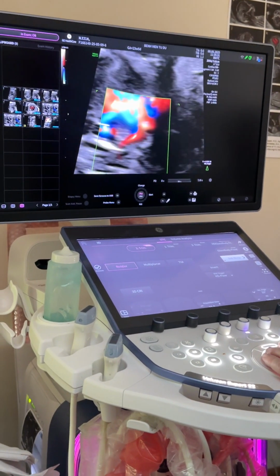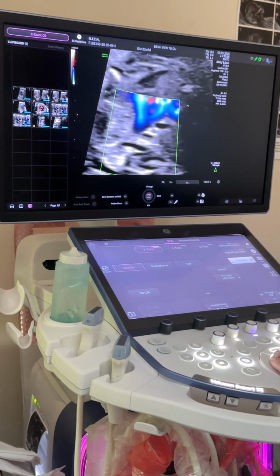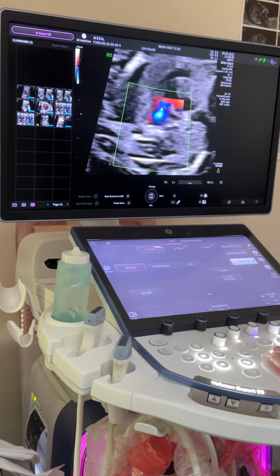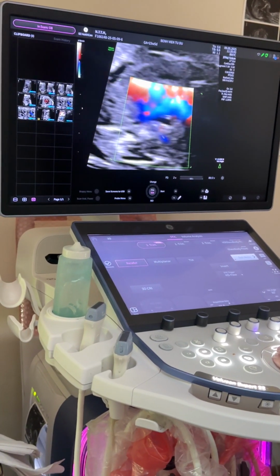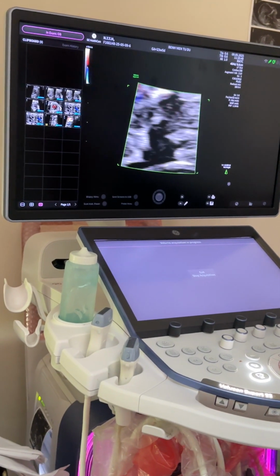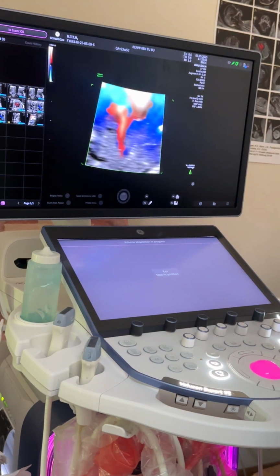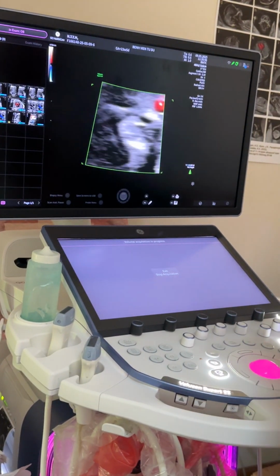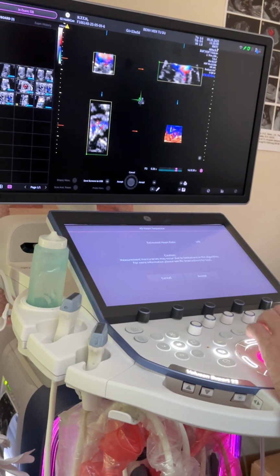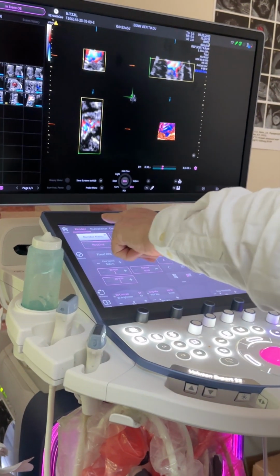Stop breathing. Breathe away normally. Stop breathing. 5, 4, 3, 2, 1. Breathe away normally. It's a good idea to count down, because then patients understand how long they need to hold their breath for. When you accept your image, I don't want rendered image, not now.